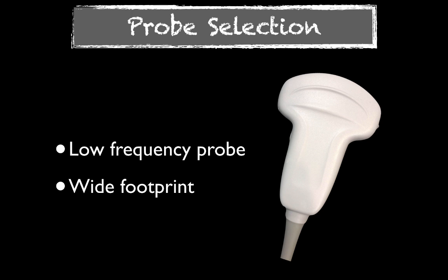For our probe, we're going to use a low-frequency probe with a wide footprint. This is important because especially in our obese population it's hard to get a good view of the aorta and we want the best dimensions we can get. The wide footprint sometimes helps displace bowel and allows you to put more pressure without making the person feel like you've punched them. As long as you apply slow, constant pressure they should tolerate it well — even a very obese patient can tolerate quite a bit of pressure when trying to find that aneurysm.